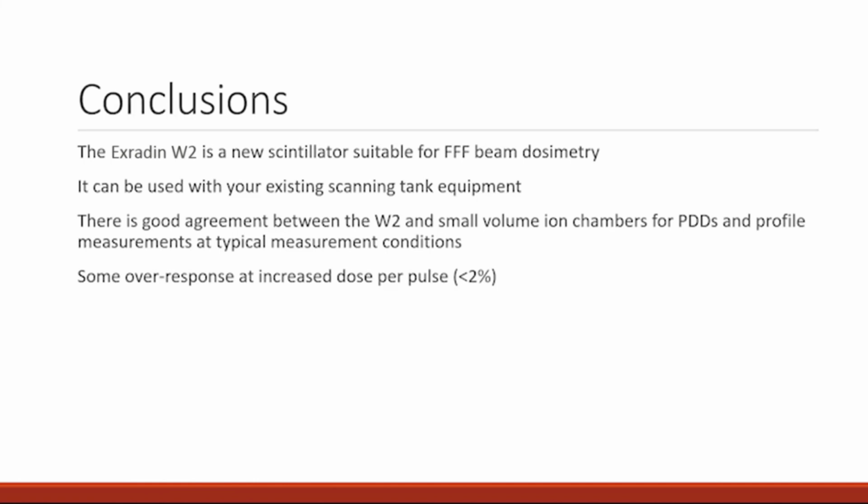Well, even if the correction is 1, it's good to get the most accurate reading that you can. And it's so easy to take that CLR measurement. I would go ahead and do it.